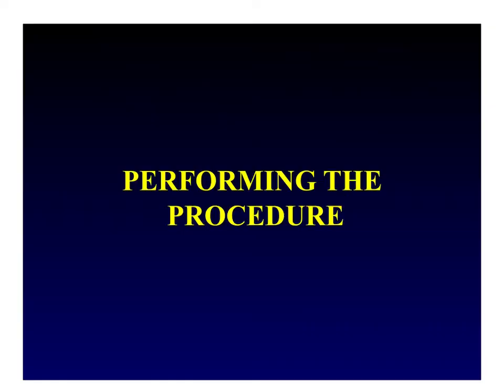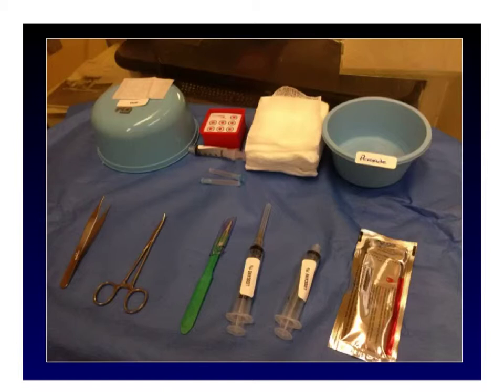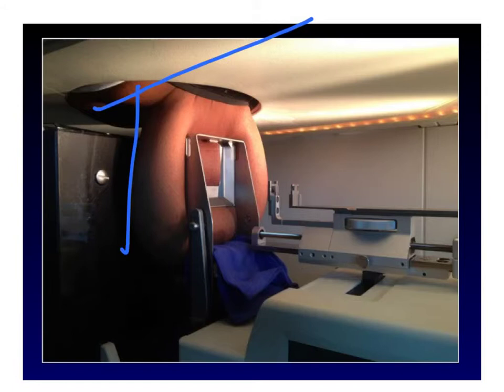Before you begin, set up your tray — including the needle guide, which we'll be using later. While you're setting up the tray, the tech will be positioning the patient on the table and placing her breast in compression. Here we have the patient laying prone on the table with her breast hanging down through the hole and being compressed in the CC view. The calcifications were located in the central breast on the CC view, and we are coming from a superior approach. We then take a scout view — an image straight on of the breast.